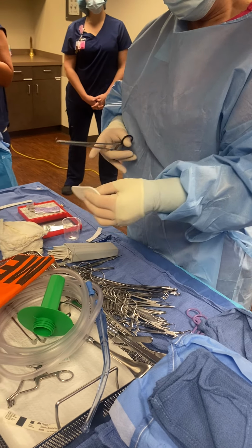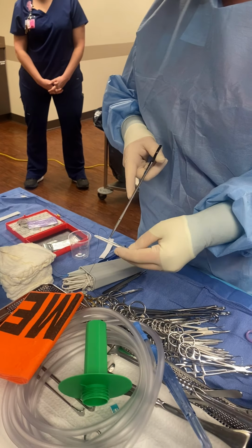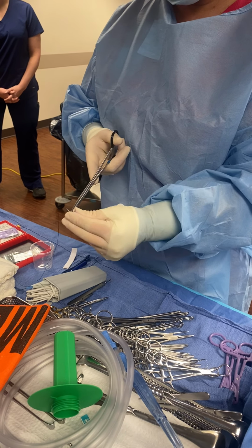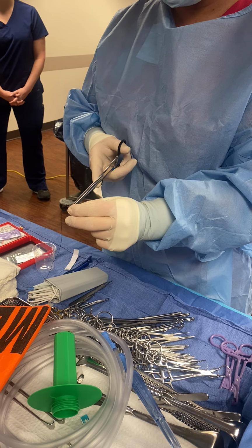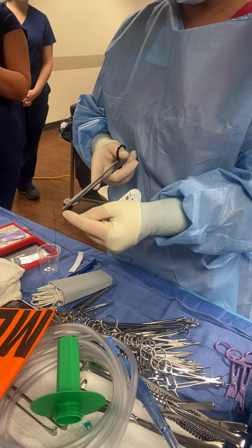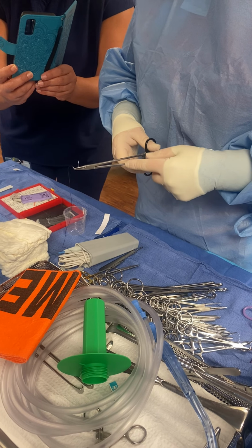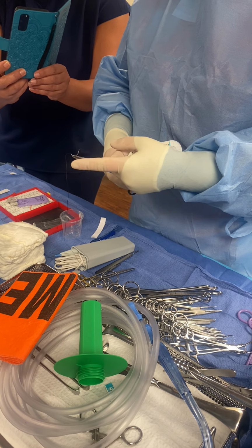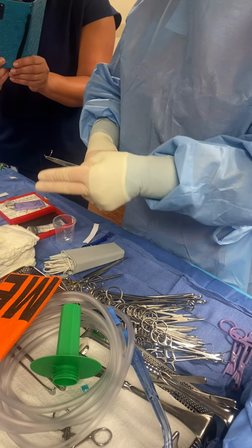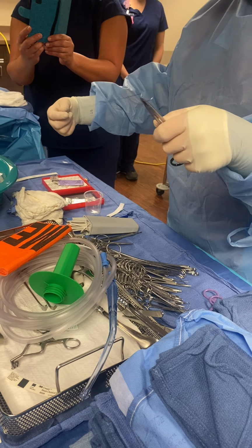So it's set in the package. I'm not going to belabor this too much, but it's set in the package for right-handed surgeons. So when you load it, you want to load it about a third of the way away from the swage and at the tip of the needle holder, all right? And for a right-handed surgeon, you know you've loaded it right because the needle should be between the two hands pointing towards the midline, like if I was the surgeon, right? So you'll see how we pass it and then we'll practice a lot.